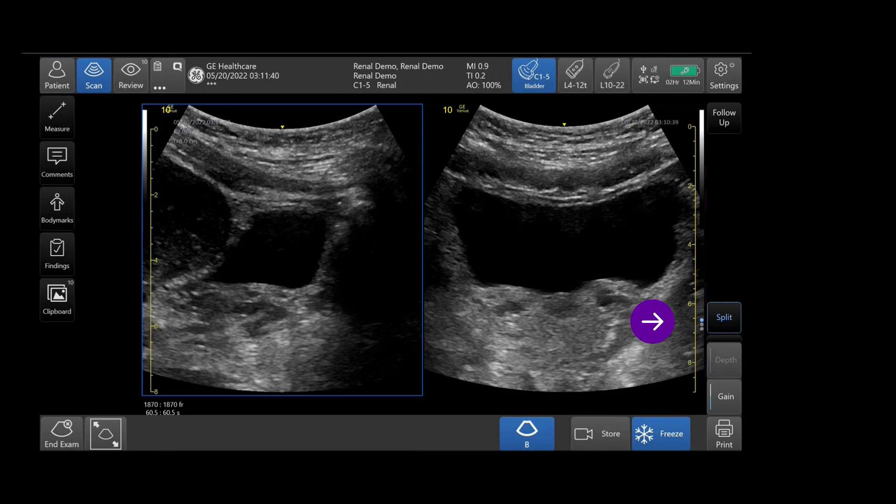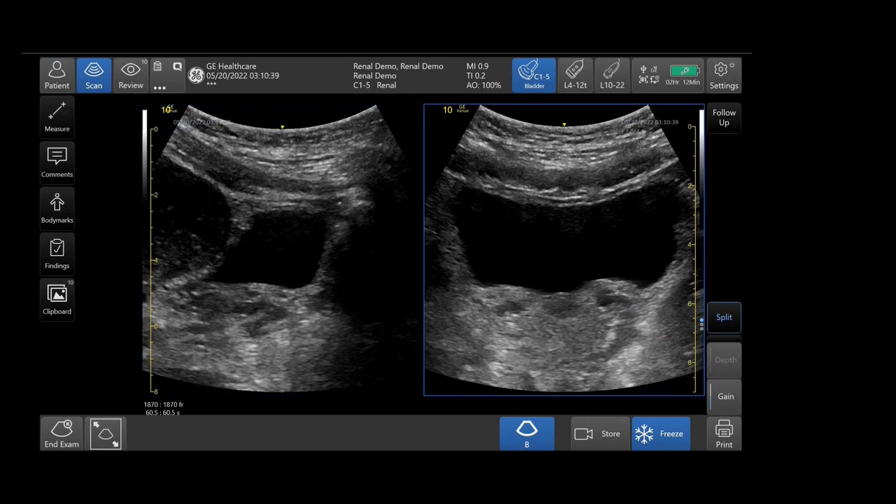You can toggle between right and left screens by simply tapping either the right or the left side of the screen.